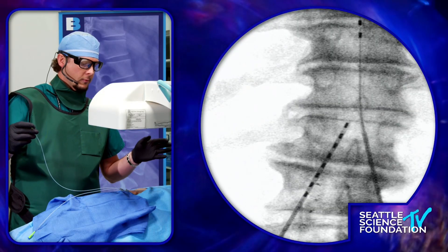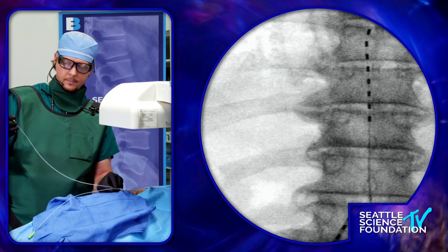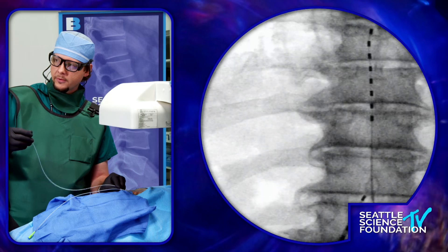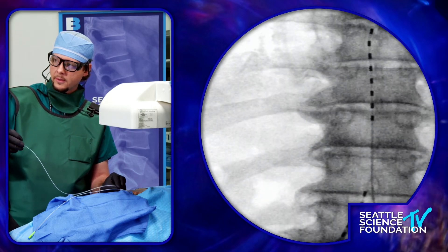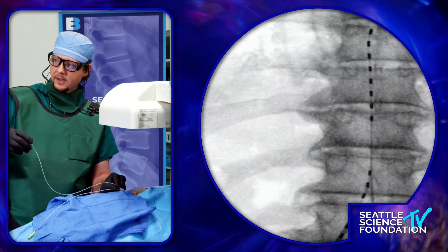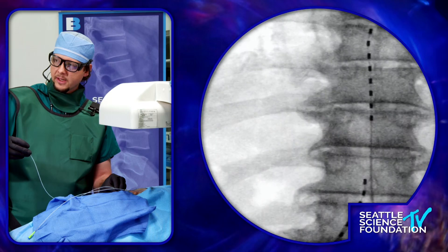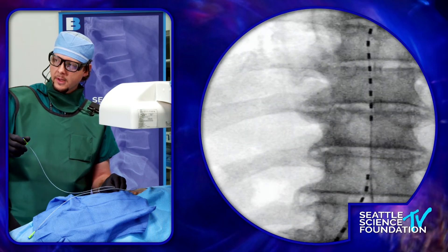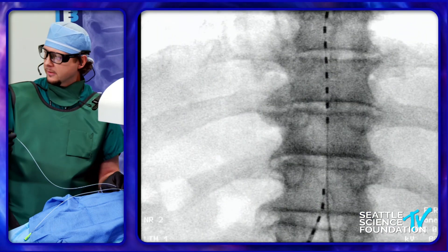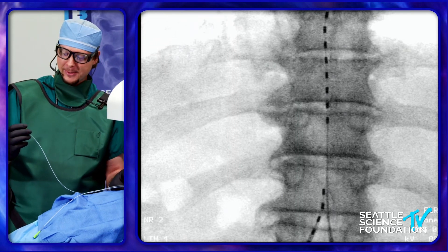I'm going to go live on the posterior view here. You might feel a little bit of resistance, and sometimes patients have some discomfort — just be mindful of that, going gently, but also trying to steer. If you can see my right hand, I've got my hand on what I call the steering wheel — the technical term is steering cap. What that's doing, as I'm turning the back, is turning the angle of the tip of the lead.